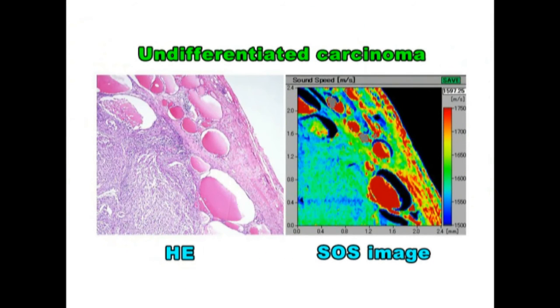This is undifferentiated carcinoma. An undifferentiated carcinoma consisting of spindle cells invades into the surrounding thyroid follicles. Some colloids surrounding the carcinomas are broken down into small pieces. The carcinoma portions are green-blue in color. The compressed follicles have condensed colloids with greater speed of sound.